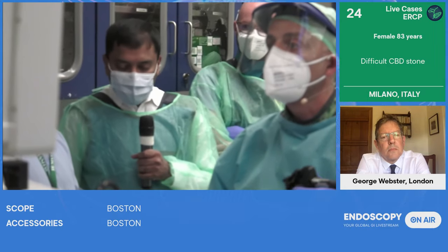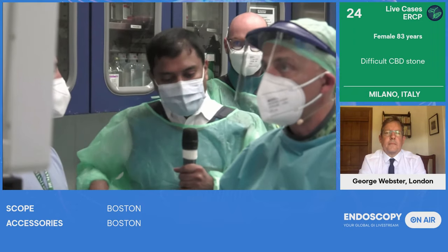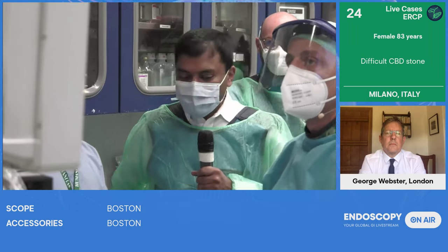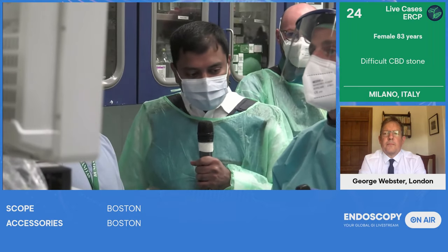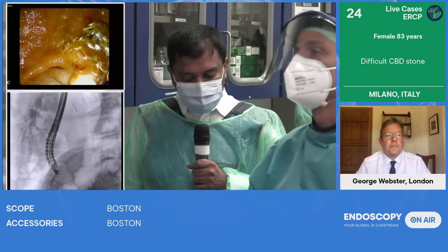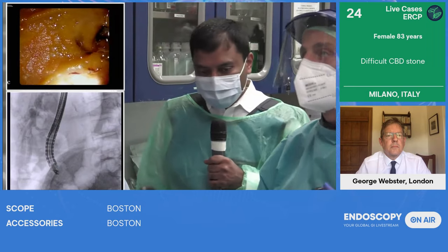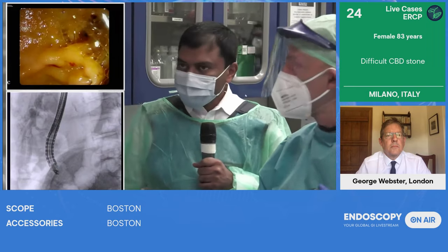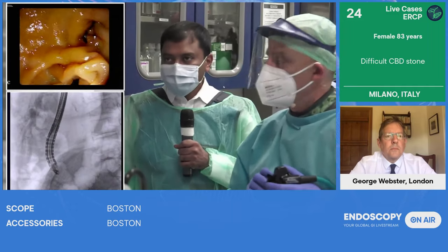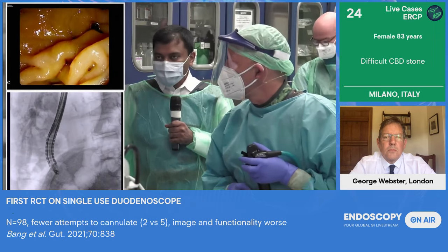the single operator cholangioscope appears to work very well with Exalt, because the scope stiffness enables easy passage of accessories through the Exalt scope. So I think it makes it easy. We did a retrospective collection of cases, around 65 cases for the combo procedure, SpyGlass plus Exalt. We are going to analyze the data, but at first sight they look extremely good, with very high technical and clinical success.